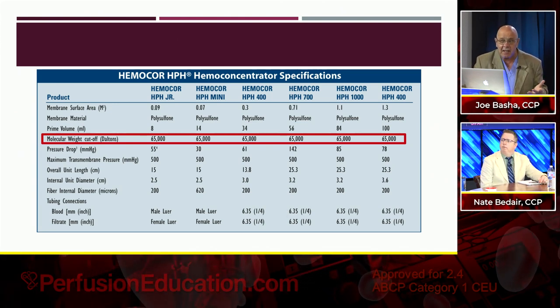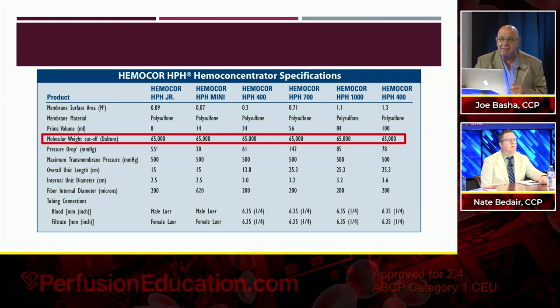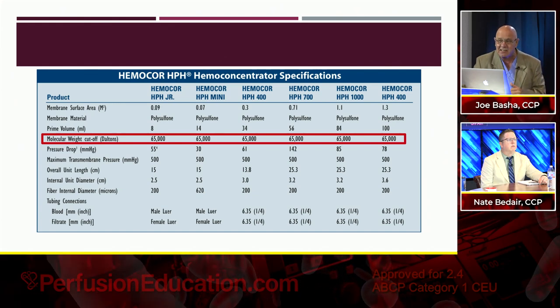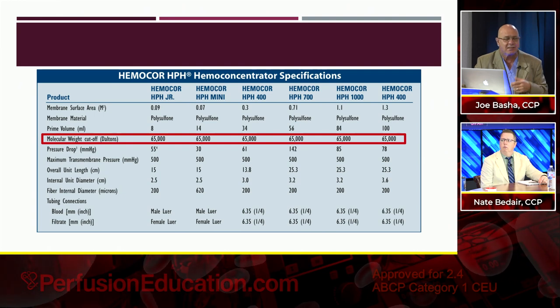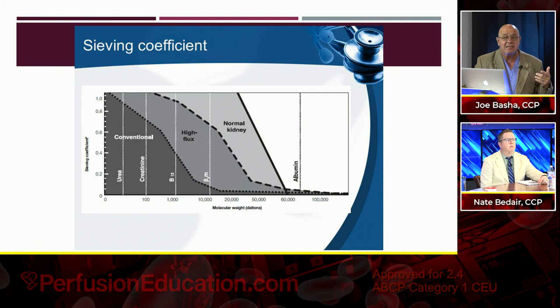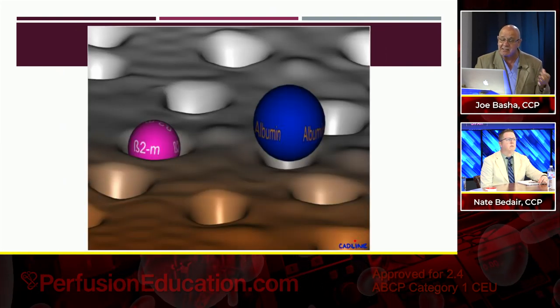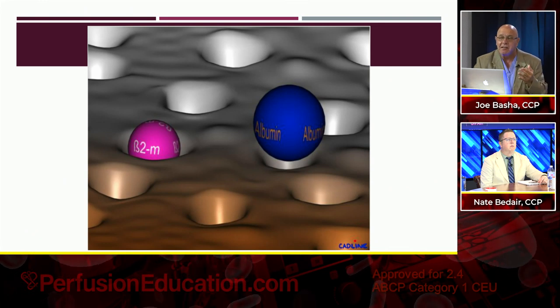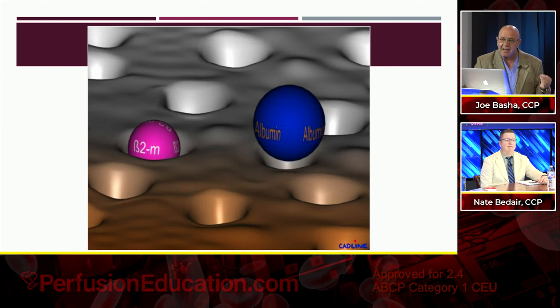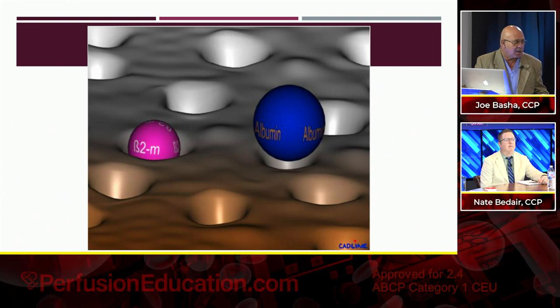We talked about the molecular weight cutoff of the more traditional filters, which is 65 KD or 65,000 Daltons. Albumin is 66 KD or 66,000 Daltons, and that's why you don't remove protein, because of the cutoff. We talked about sieving coefficient and how important that is to understand. The molecule is too big to go across the pore. It isn't going to go. The other molecule that you see there can easily go through. Right. Okay.